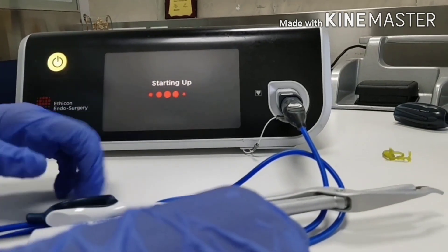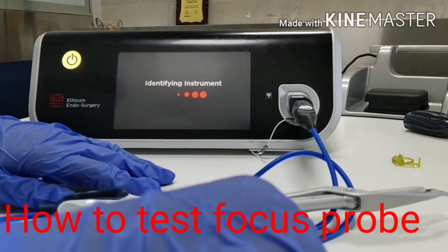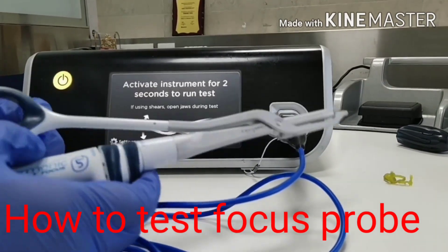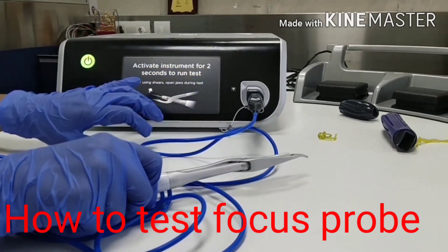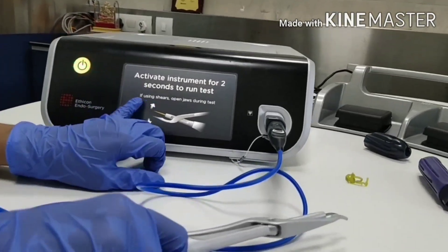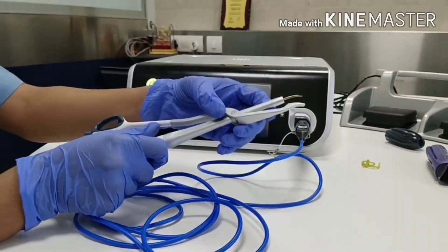It will take 10 seconds to start. It is identifying the instrument. Now it is asking to activate the instrument for two seconds to run the test. It is also showing a message: if using shears, keep jaws open during the test.